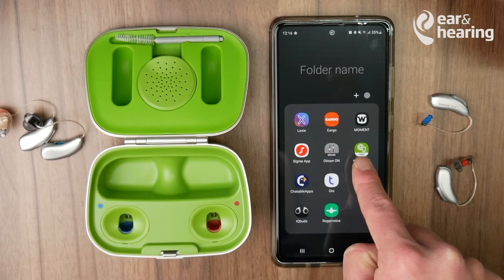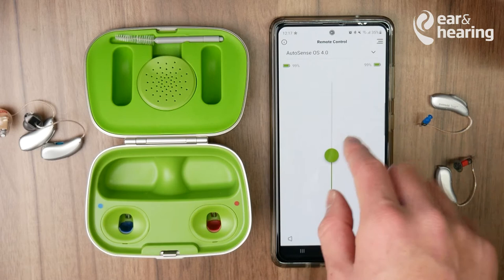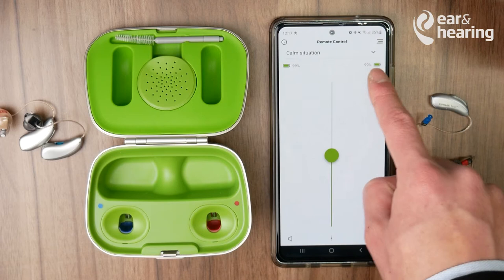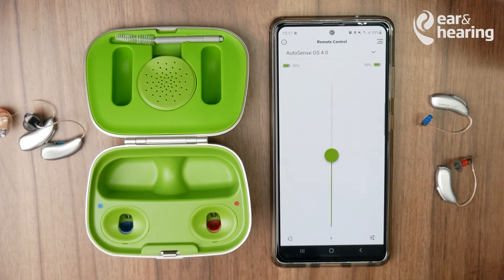Once you've done that, go into the My Phonak app. After a few seconds, you should see that both hearing aids are now connected. Once connected, you can also see the battery percentages — 99% on both sides — and adjust the volume control and the different programs which are available.